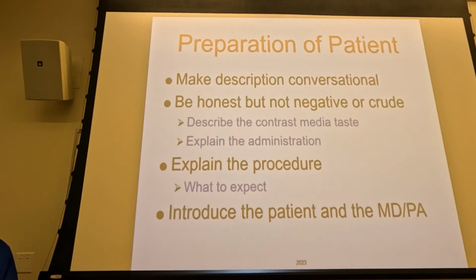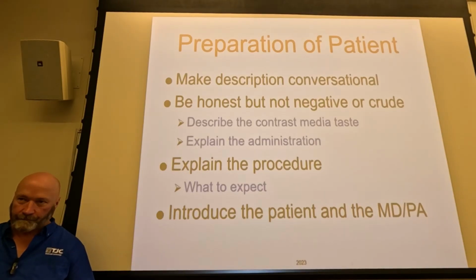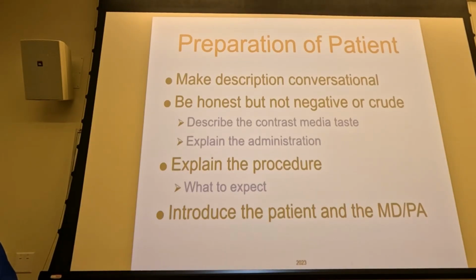So if they're dehydrated, what's going to happen to the barium? That is exactly what's going to happen, it's going to suck the water out of the barium, and now they're constipated, right? So what do you need to tell the patient post-procedure? Drink a lot of water. Drink a lot of water, right? So we tend to stress that on barium exams, but what about iodinated? Well, they're coming to us dehydrated, and what are we going to give them? Contrast. A contrast that acts as a laxative. So how are you going to send them away from you?